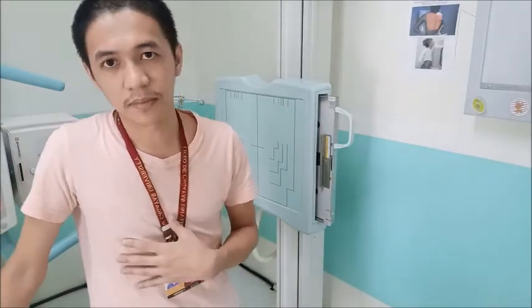So in that case, if the mother of the patient is pregnant and there is no other companion, the next person who can hold the patient should be the orderly, not the radtech. Okay? The radtech is the last resort as much as possible.